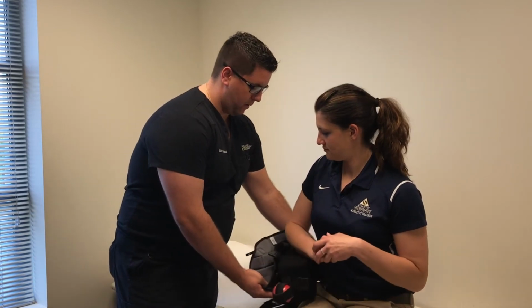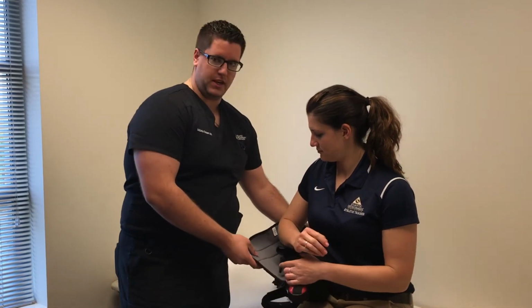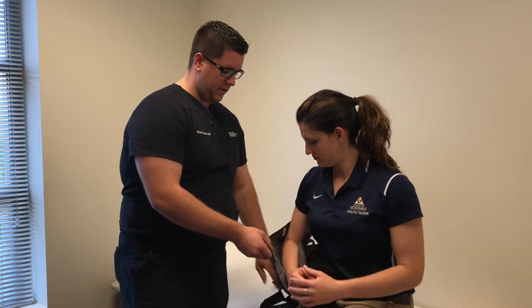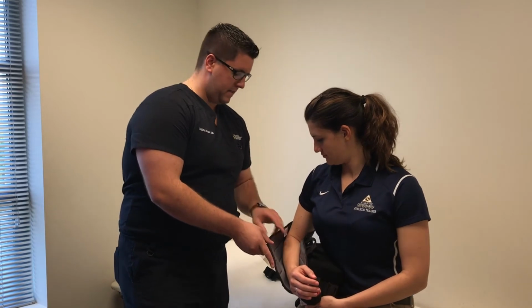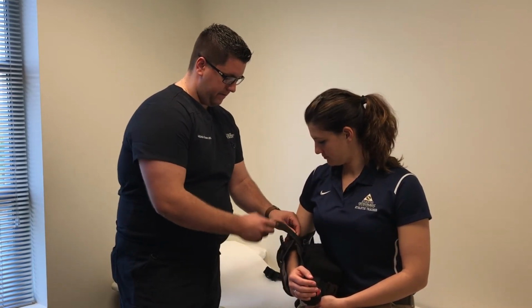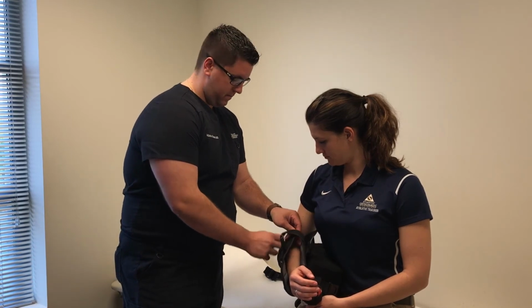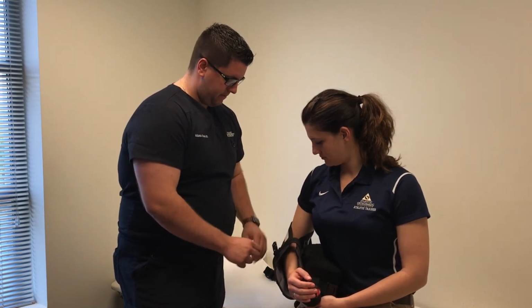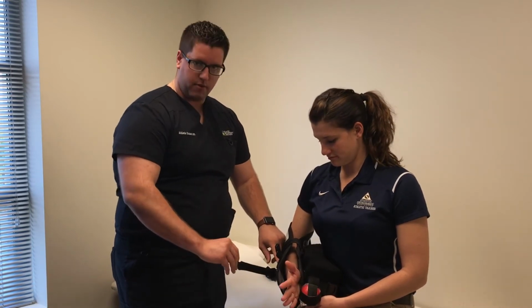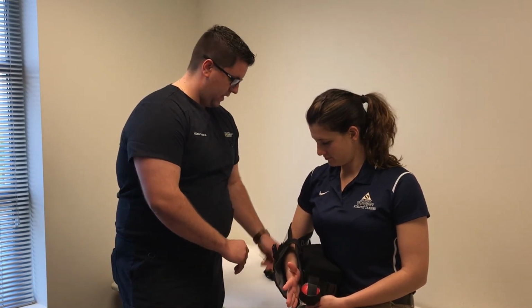So I'm going to wedge the pillow up underneath here. It contours nicely to the body. And then place the elbow in the back of the sling. And then you have at least something to rest it in already. The next step after that is to close up the arm, just like that. Also the thumb strap, which is on the side right here, is Velcroed on. We'll put that on last.